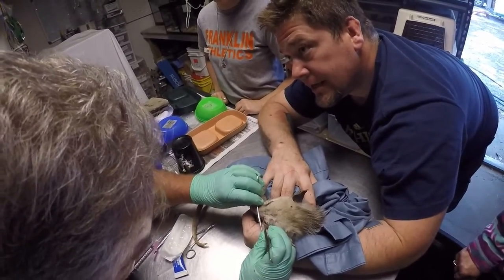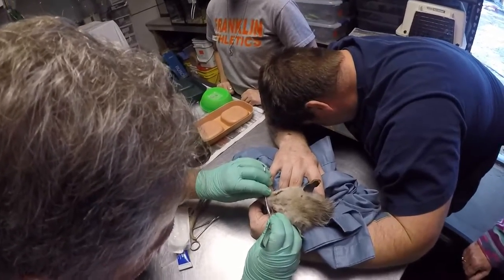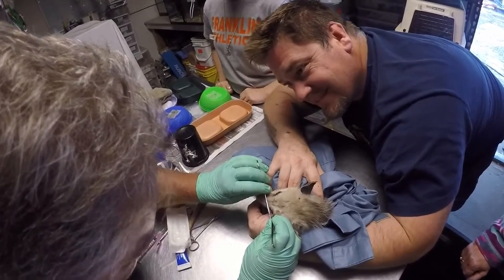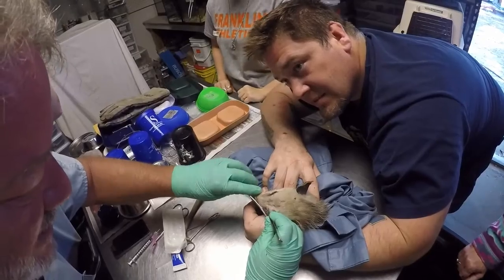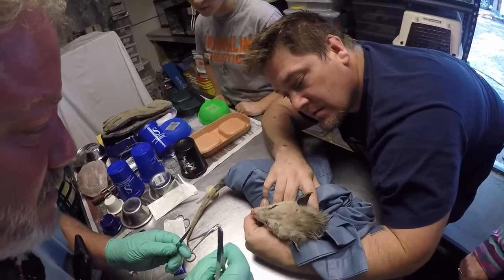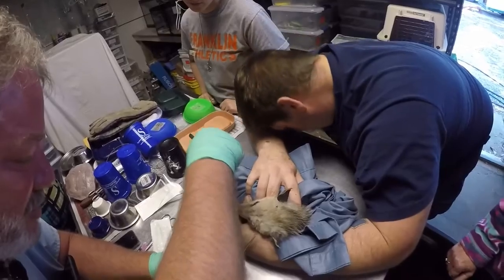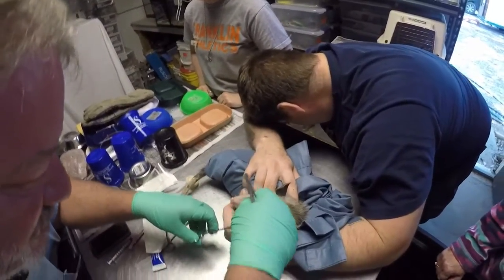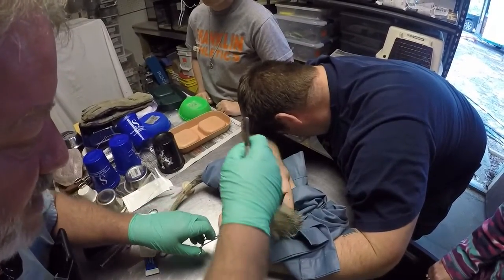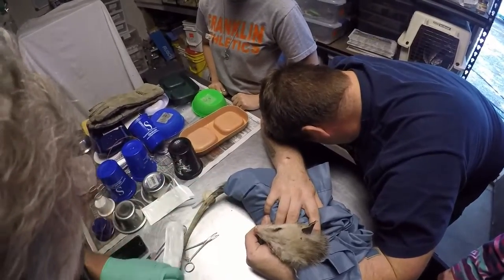We numbed it and now we sewed it. He's right here. Can you just tell us what you did? We numbed the eye. The eye has a ring block — a lidocaine ring block. This eye actually has some major dry trauma to it. So what we're doing is suturing this eyelid shut for a bit, so Mother Nature can decide what's going to stay and what's going to go. Then we may end up having to do an enucleation, but chances are this will just heal and this guy will live a normal life.